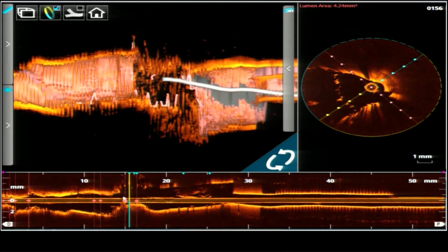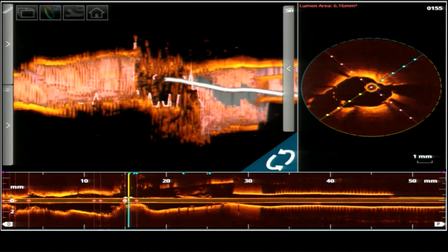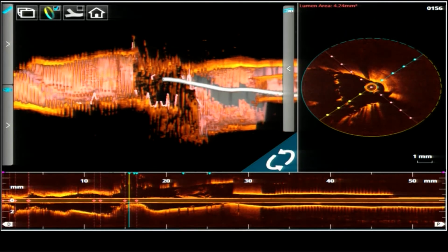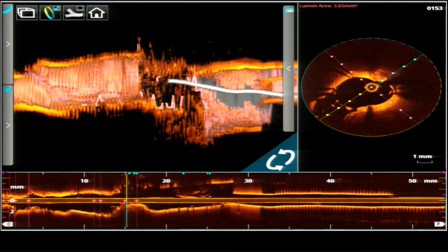One more thing: when you put the first circumflex stent, before crushing it is better to do a good POT and then crush the circumflex stent. These are some of the points we have observed that might help you get better results and a better bifurcation point.